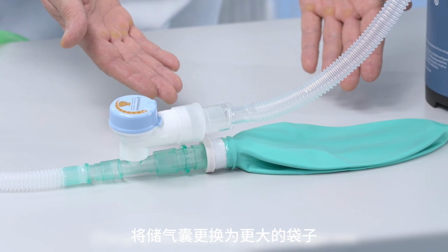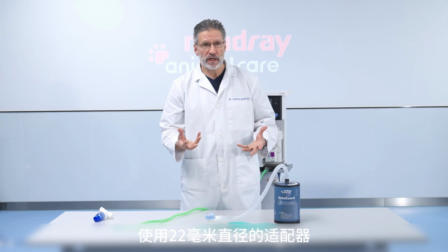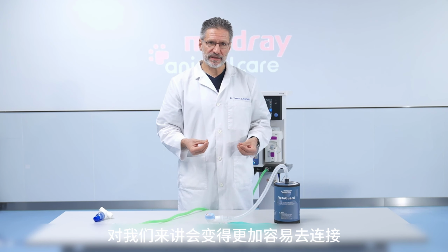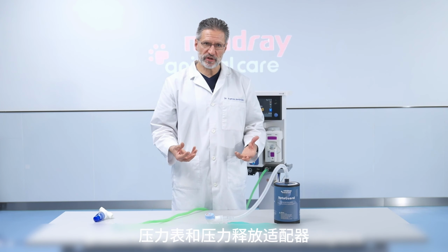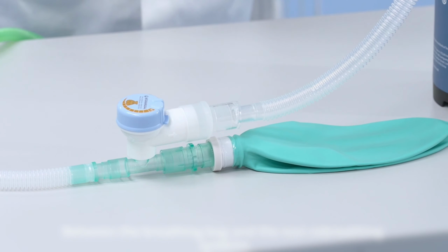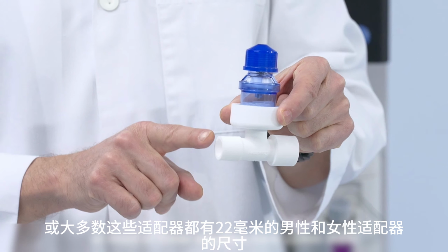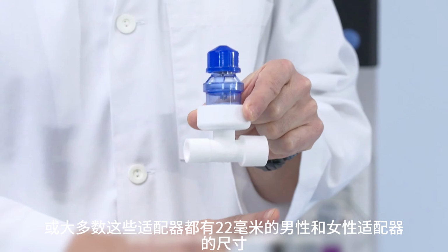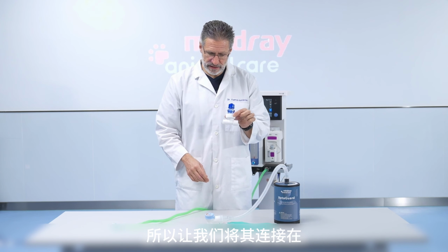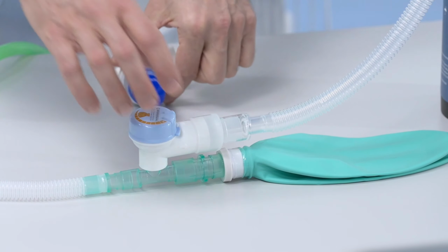Changing the breathing bag to a bigger one with 22 mm adapter size offers other advantages. It makes it easier for us to connect pressure gauges and pressure relief adapters right here between the breathing bag and the non-rebreathing system, because many or most of these adapters have 22 mm male and 22 mm female adapter sizes. So let's connect it at the neck of the breathing bag.